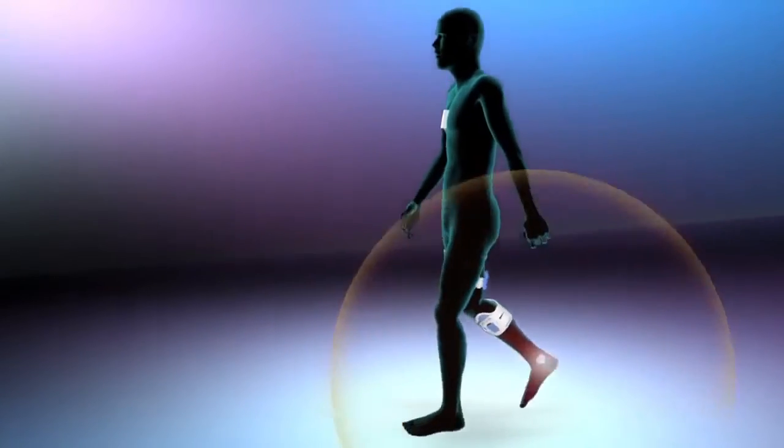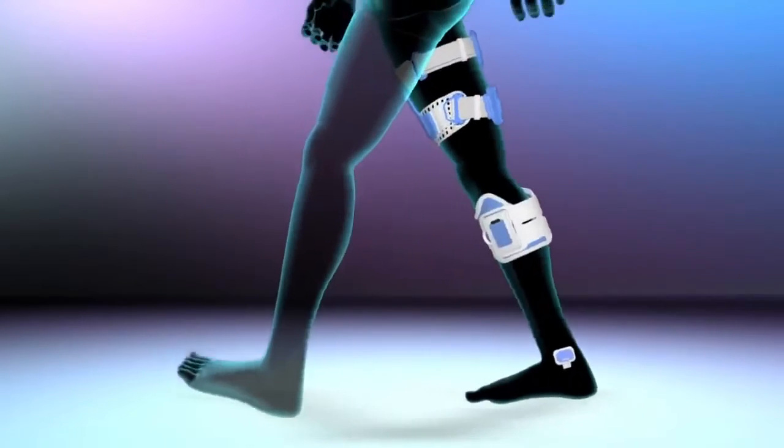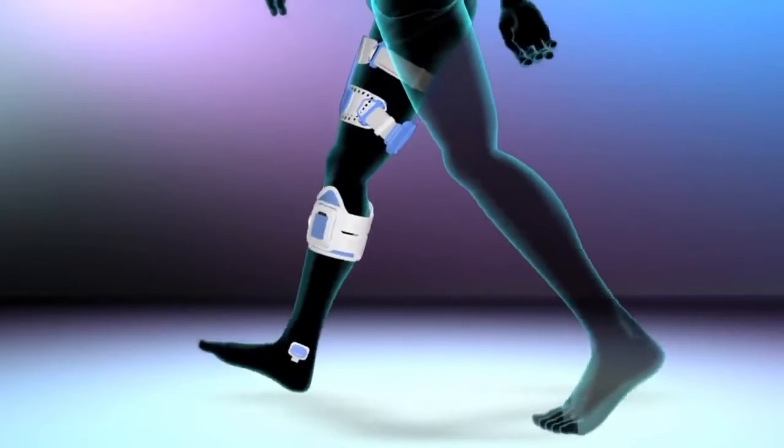While walking, the patented gait sensor detects the position of the foot and transmits wireless signals to synchronize the electrical pulses delivered by the stimulation units on the leg and thigh cuff.